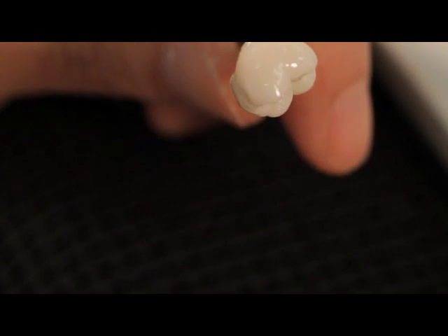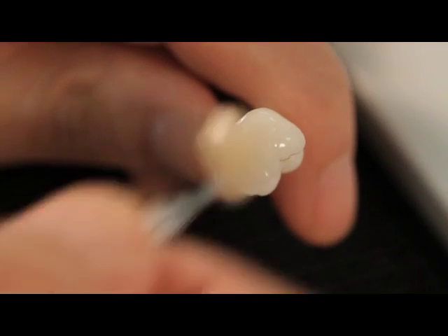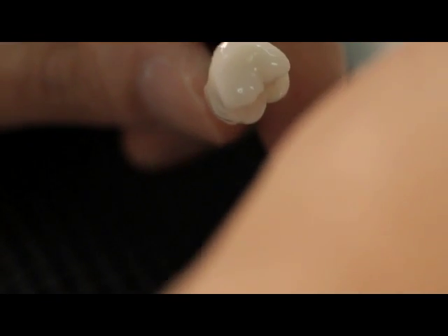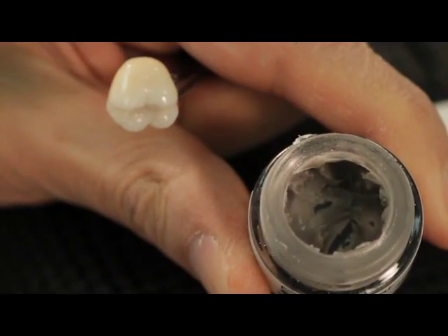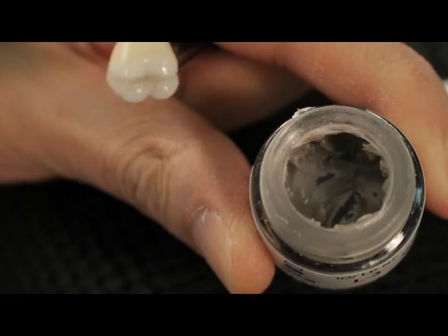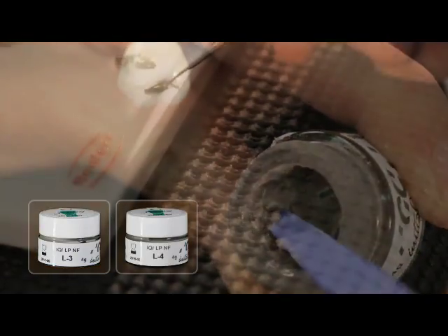This process, which only takes two minutes, is everything which is necessary to create Vita Pan Classic shades. In order to achieve the higher gray value of the incisal area with darker teeth, two gray effect shades can be used: L3 Light Gray and L4 Dark Gray.